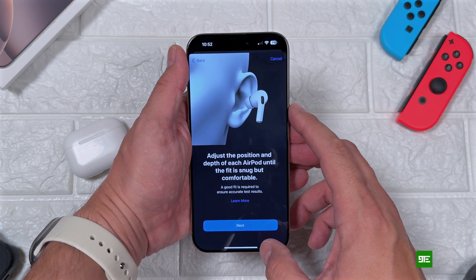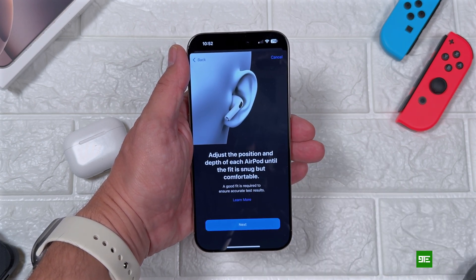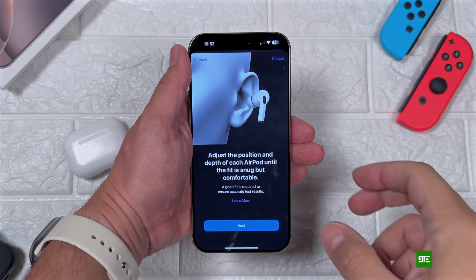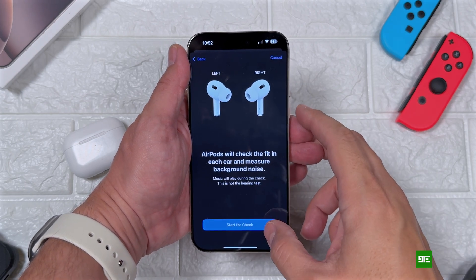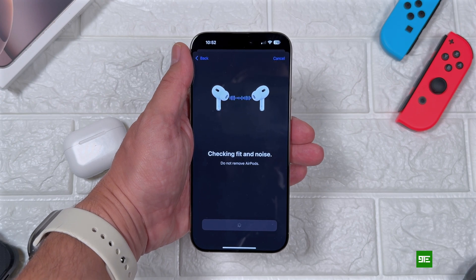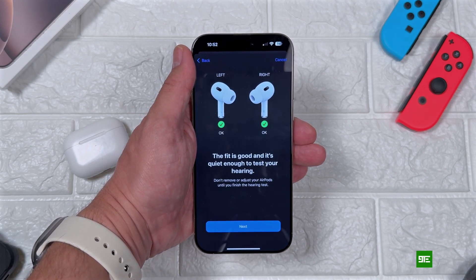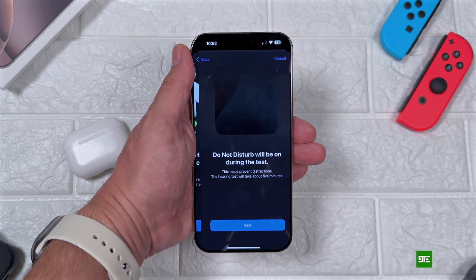Now you need to wear your AirPods Pro 2 and of course have a good fit on your ear. The iPhone will check if the fit is okay so that you can get the hearing test correctly. If it's okay, you will see these checkboxes and hit next.